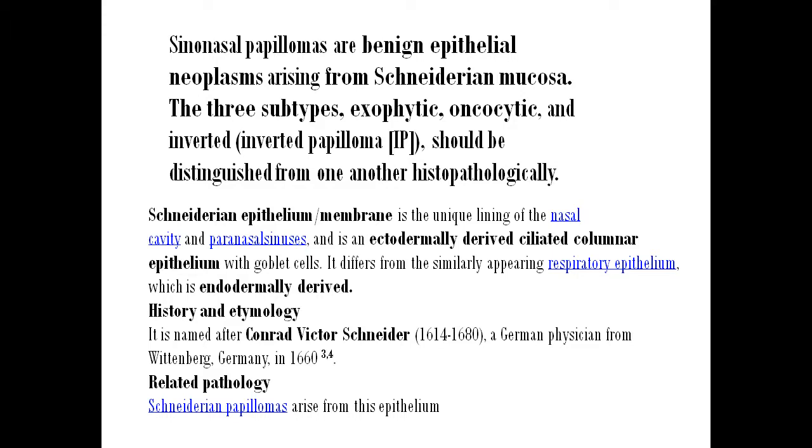Schneiderian papillomas arise from this epithelium, which is a unique lining of the nasal cavity, ectodermally derived ciliated columnar epithelium with goblet cells.